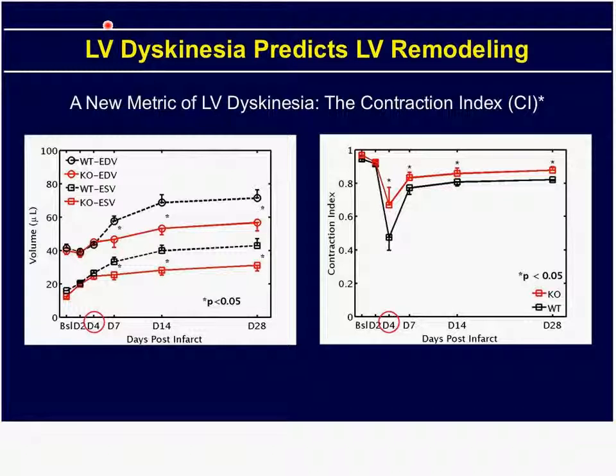But even those centers that have them tend to use 2D, because 2D slices are of higher resolution. You give up a little bit in acquiring those volumetric slabs all at a single time.